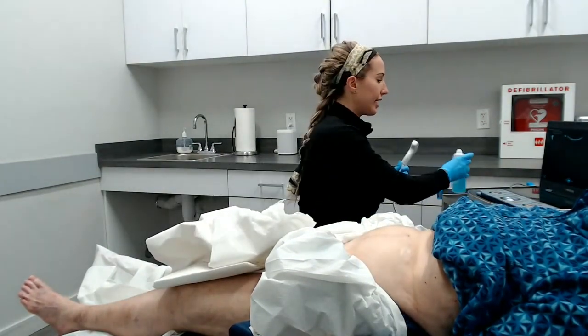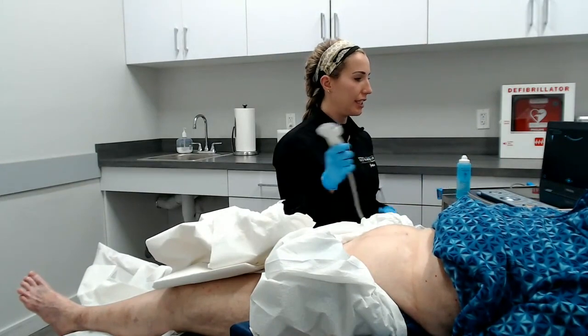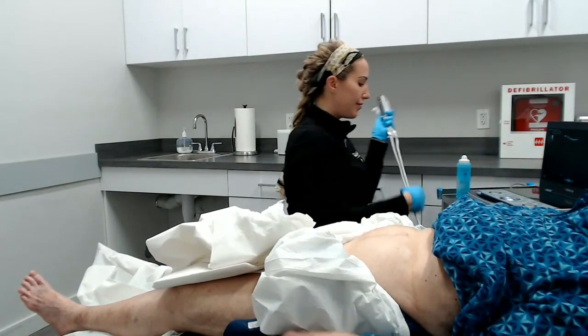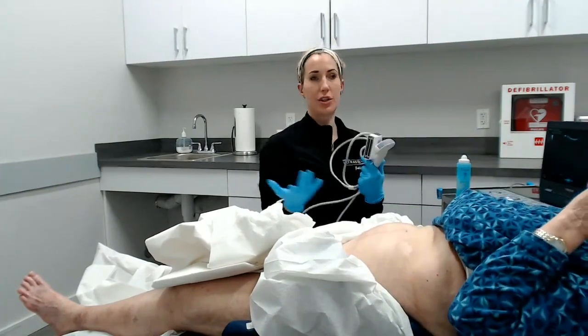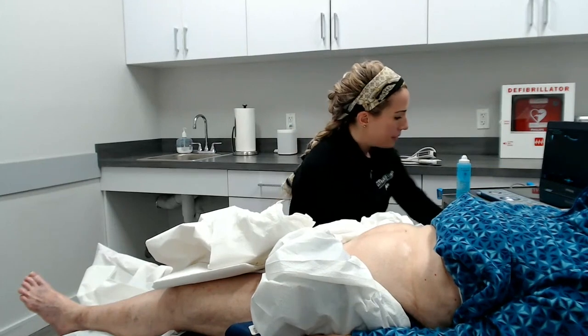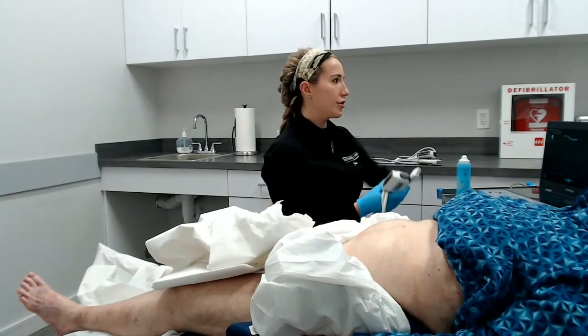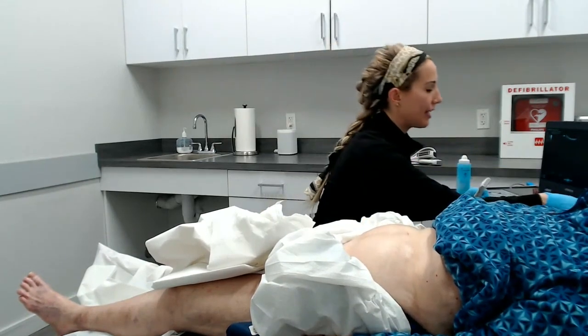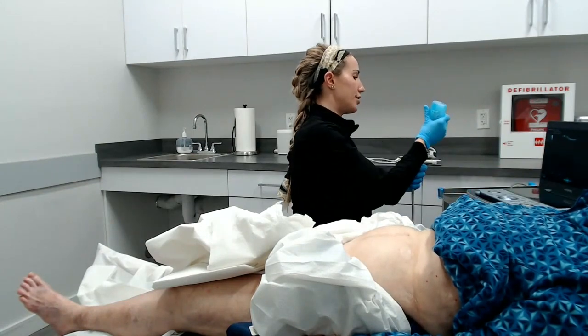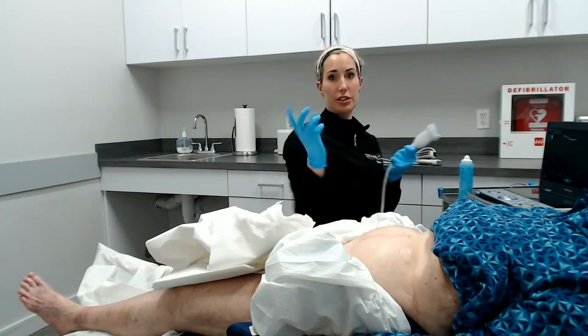Oftentimes, if I can get lucky enough, I can actually use the linear transducer. So what I'm going to do is switch that out. And some facilities actually don't have access to a curvilinear transducer. So I would just activate the linear transducer and plug it in and just see if I can get a better image with the linear transducer. So let's just see what that looks like as well.